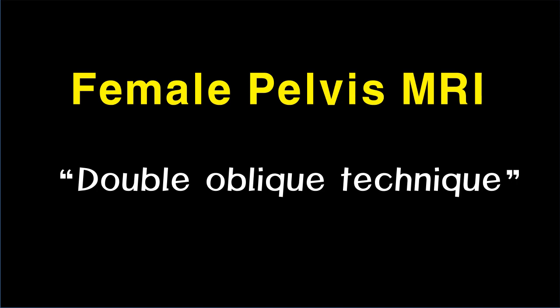This time, we will look at female pelvis MRI. Gynecologic cancers include cervix cancer, endometrial cancer, and ovary cancer. Pelvis MRI is widely used as the best imaging test that provides important information in the evaluation of the size, extent, and presence of metastasis of a lesion.